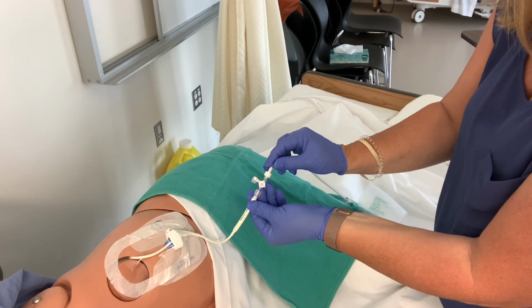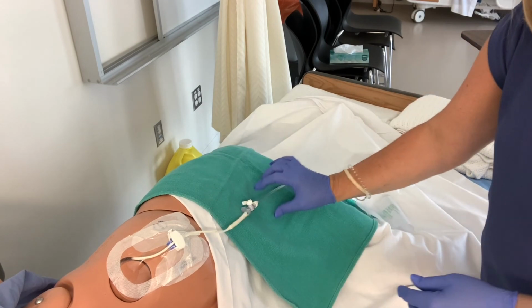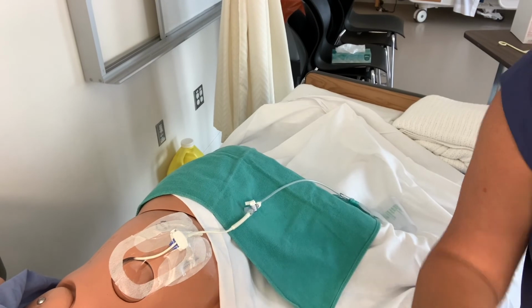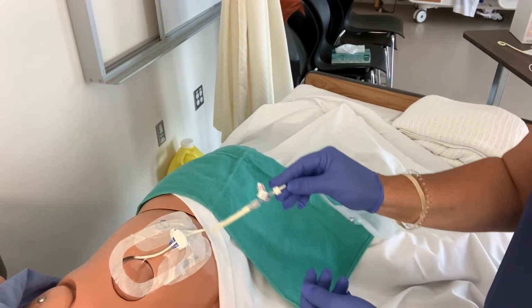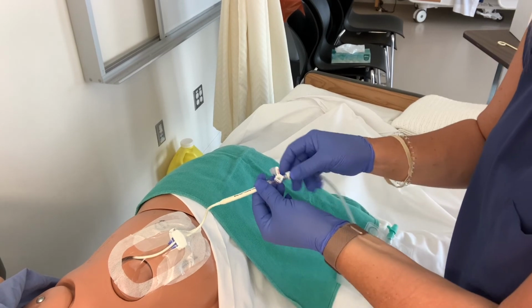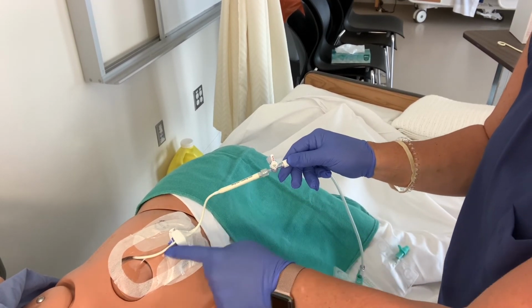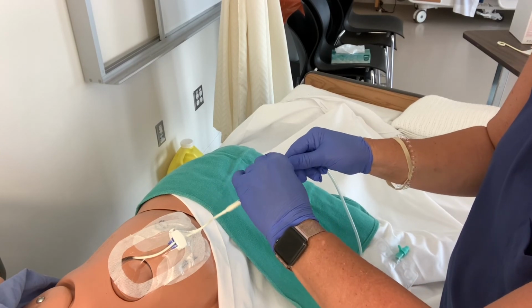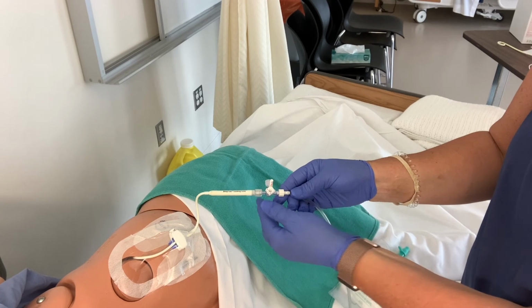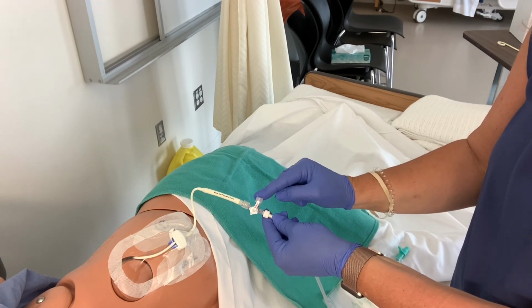Okay? See that? I'll see if I can zoom this in a smidge. Maybe not. I'll try to pick it up a little bit closer. I just want to show you the stopcock. When it's inserted with the patient, there is a kind of funky device here, and it's called a stopcock. Now, if it was a two-way stopcock, this third port wouldn't be here.